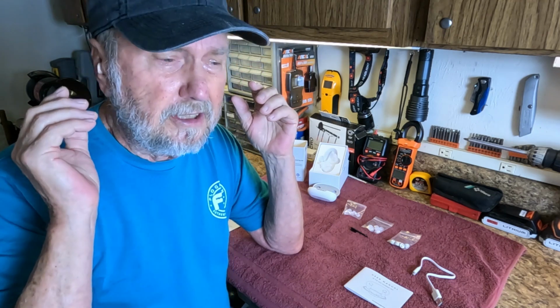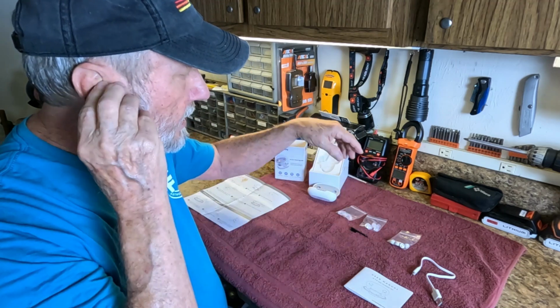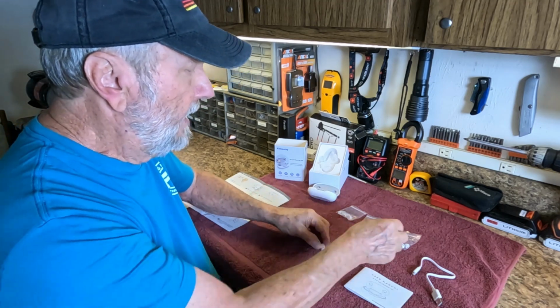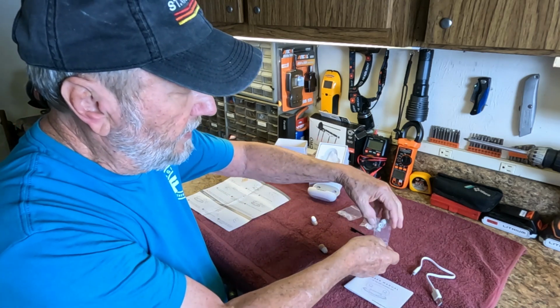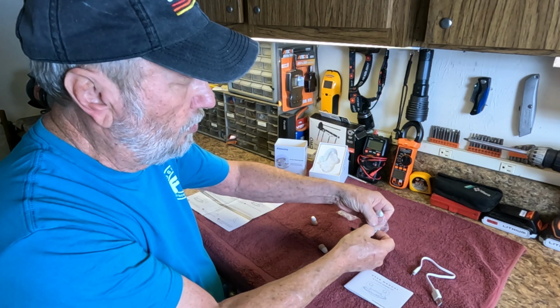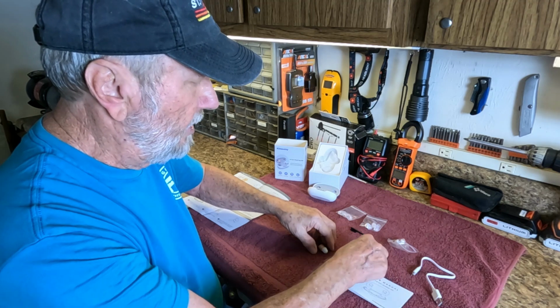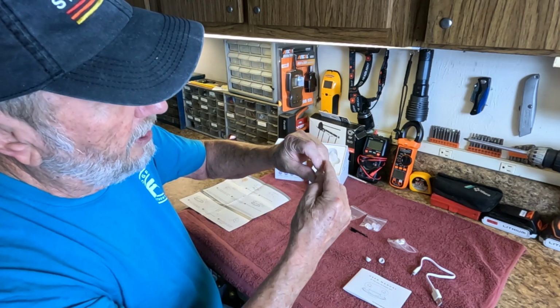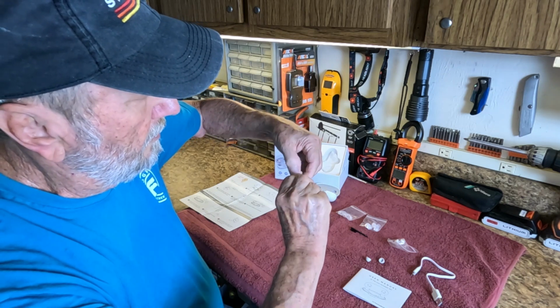Now, you feel for comfort. Do they feel good? Do they seem like they're going to hold in? If you want to try a different ear tip, let's try that, and I'll show you the technique to replace them. Now I'm going to try the foam tip that they recommend, because it really conforms and holds to the shape. These others are just friction mount. They don't actually contour exactly to the shape like the foam does. Now, to pull this off, you just kind of peel these back like this.